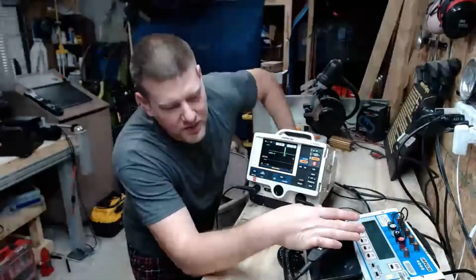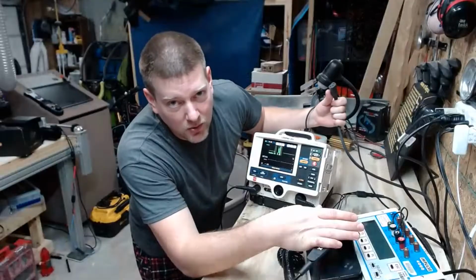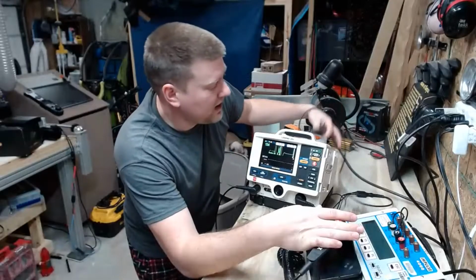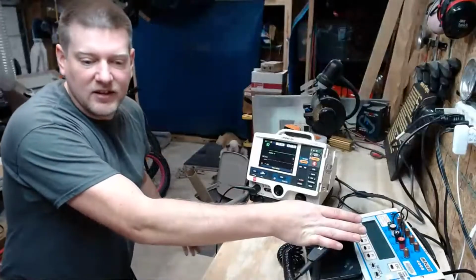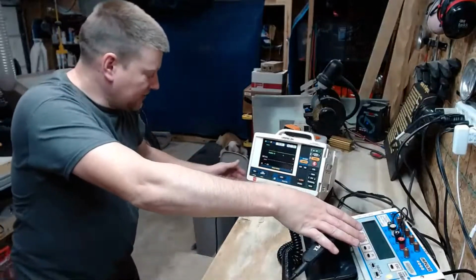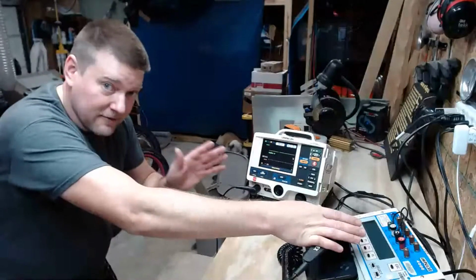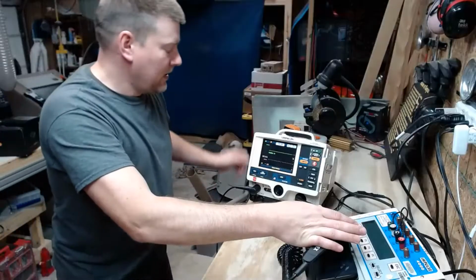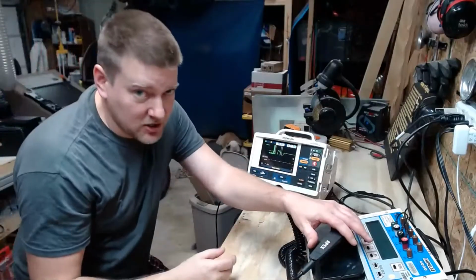So one of the best ways to test your defib is to pull the power cord. When you walk up to a defib and you start checking it out, pull your power cord, and I leave it dangling right over in front like this. Oh, you can't see it. Leave it dangling right in plain view. That way, you know that, hey, I left it unplugged, right? So I'm doing all my energy output tests and everything. I'm doing a lot of shocks.